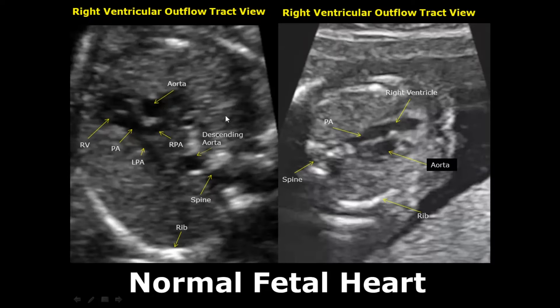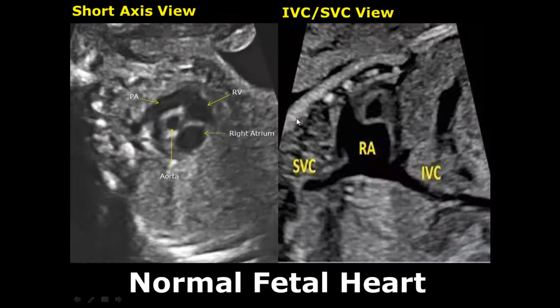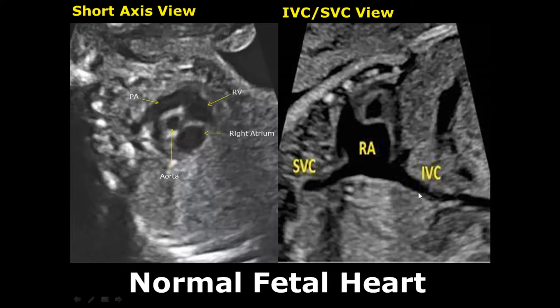The short axis view gives us a cross-section of the heart. We can see the aorta, the right ventricle, and the main pulmonary artery. The IVC/SVC view gives us a longitudinal view of the superior vena cava and the inferior vena cava along with the right atrium.